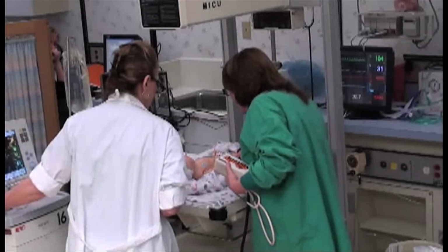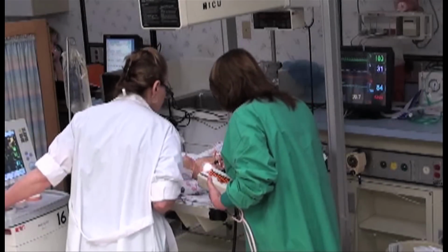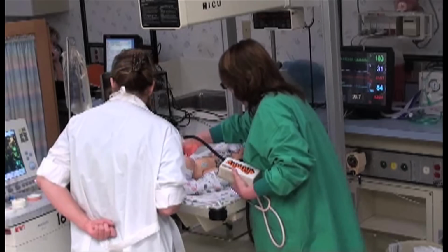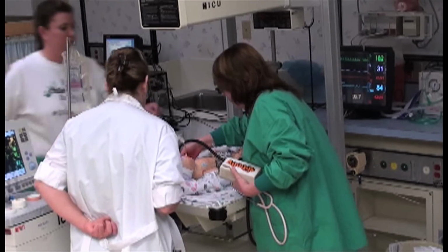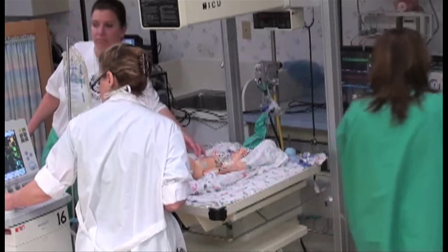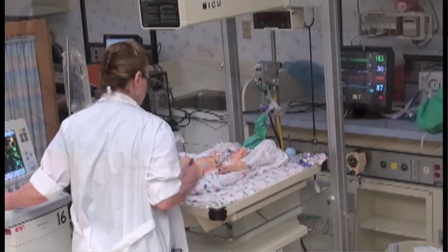I'm not seeing any chest rise at all. I'm not seeing any chest rise. Hey, can you come in room 12, please? We're having a little bit of trouble. Transilluminate's negative, Colleen. Okay, let me listen to this.